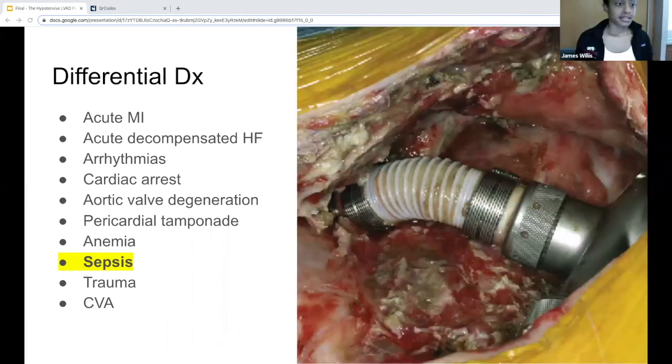Infection and sepsis: infection is the most common complication, with driveline infections being the most common. You can also have infective endocarditis, mediastinitis, pump or cannula infections, and pump pocket infections, like in this picture, an infection of the space where the pump sits. They require drainage and debridement, device removal, or some patients can actually be considered for chronic antibiotic therapy. Some drivelines cross the diaphragm, so that risks abdominal bacteria infecting the device. Do the whole sepsis workup and treat with broad spectrum antibiotics.